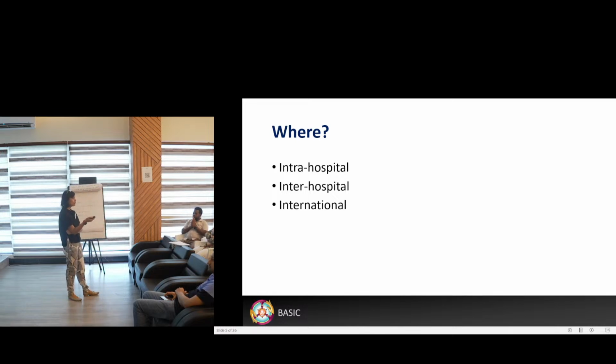Now the only thing I'm going to think is, before I leave the ICU, so in fact once I've made a decision my patient's got to go, I get the portable ventilator out, I put the patient on the ventilator, okay, while I do all the other things, which is get the nurse to set up all the drugs. I call the CT scanner, I ask them what time do you want me there, and then before I'm going to physically leave, you've got to make sure you call them again to make sure they're ready for you, okay.